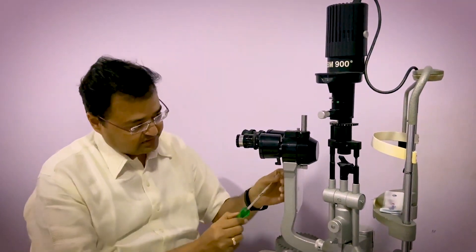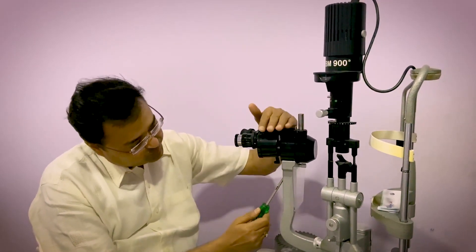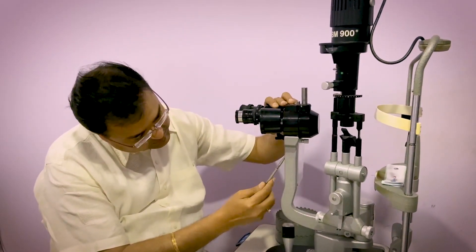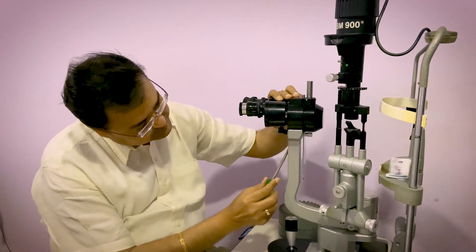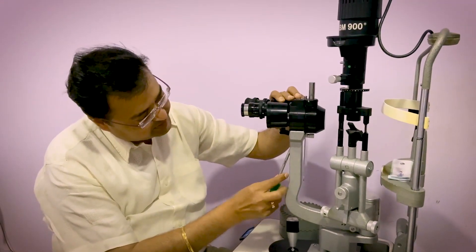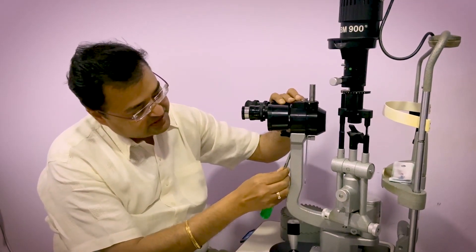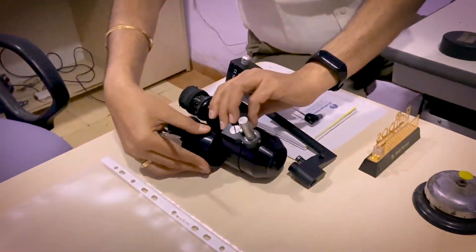Then take a screwdriver. There is a screw here in the Haag-Streit slit lamp. You have to take out the screw by supporting it. So this is the way. You have to make sure that you are holding the eyepiece so that it doesn't fall down. And unscrew it properly. Throughout the procedure, make sure that you don't damage the attachment. Now this is the eyepiece which has been removed and has been placed safely on the table.